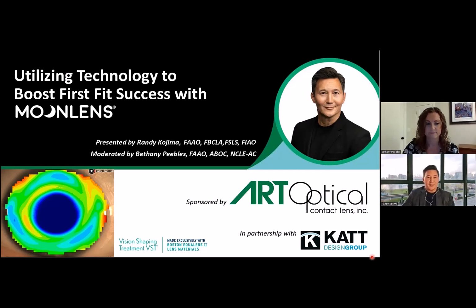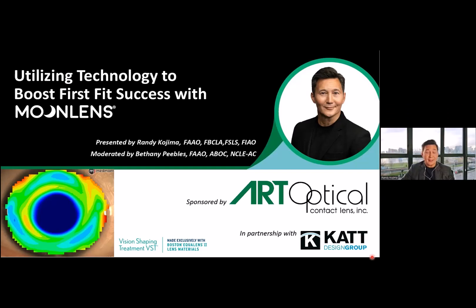Awesome. Thanks, Bethany. And thanks for this opportunity to talk to everybody about MOONLENS and this KATTCloud that we're going to discuss tonight. As Bethany said, this is the third webinar on the system. And this one's very dedicated to how you would more manually input information if you needed to. So if you have a linked topographer, then the second session is probably most appropriate to you. If your topographer is not linked, then this is the right video to be taking part in.